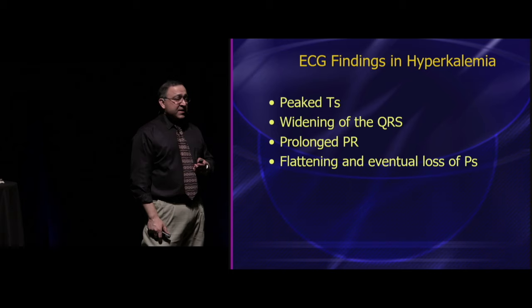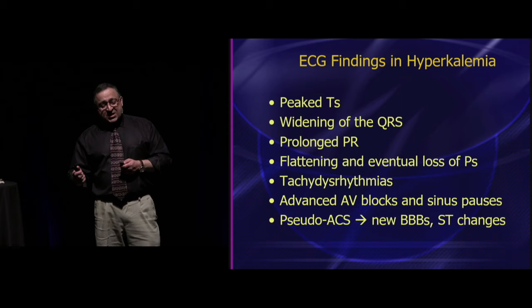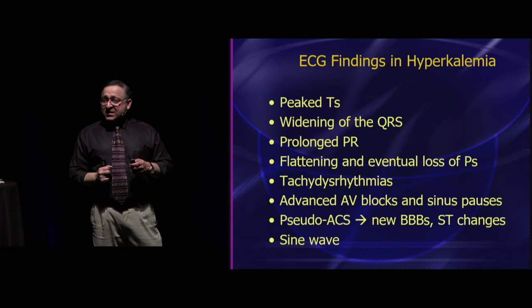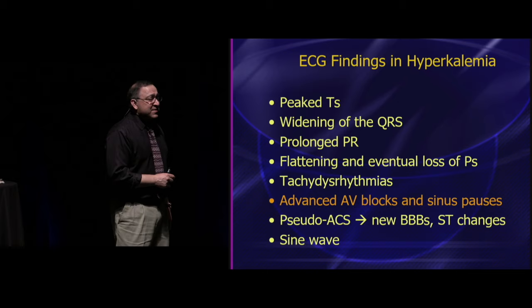But what else can hyperkalemia do? Tachy dysrhythmias, brady dysrhythmias, strange, bizarre AV blocks. It can cause ST elevation, ST depression, new axis changes, new fascicular blocks, and of course the sine wave that every medical student knows about. So everybody learns about the peak T wave, wide QRS, and sine wave, but there's a lot of things that hyperkalemia does. I always refer to hyperkalemia as the great imitator or the syphilis of electrocardiography, right? It can do anything. So especially this AV block thing, and for whatever reason, I don't know why it's not commonly taught.